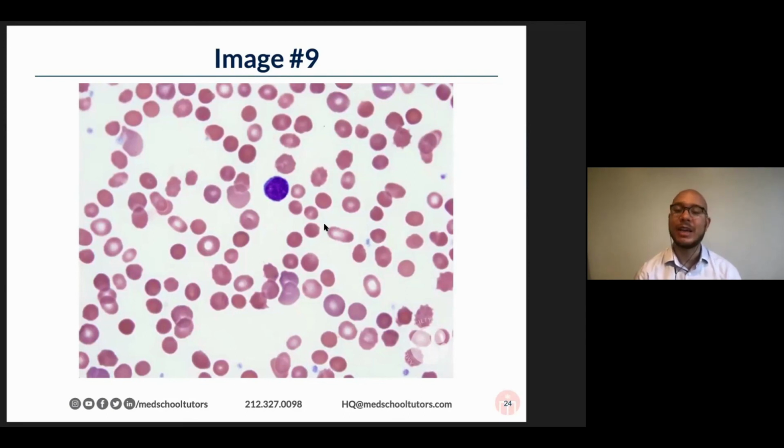Yeah. And you're sort of going down the rabbit hole with these things, because anemia is one big bucket. Then you have spherocytes, which has its own set of differentials. Below spherocytes, you have hemolytic anemias. Below hemolytic anemias, you have autoimmune hemolytic anemias. And within autoimmune hemolytic anemias, you can have both warm hemolytic anemias and cold hemolytic anemias, depending on which immunoglobulin class is implicated in the pathology. We'll go over details of that in the next slide.